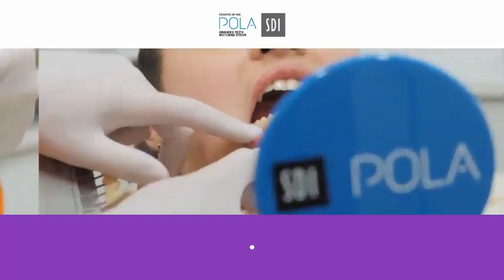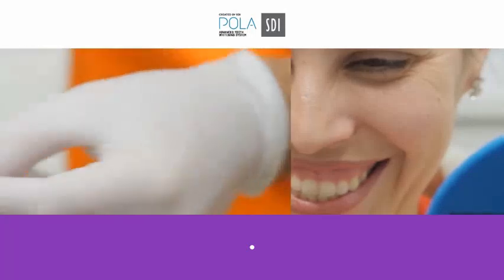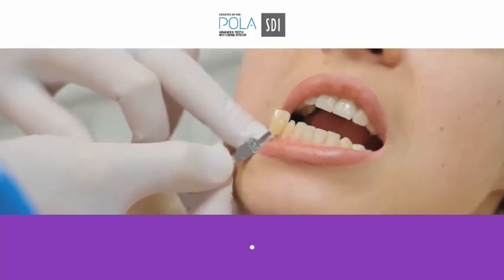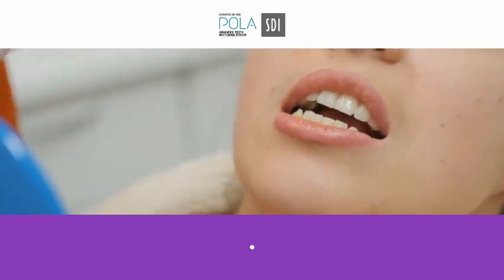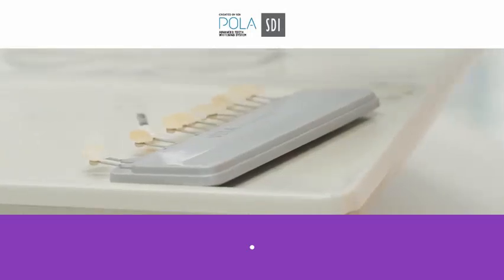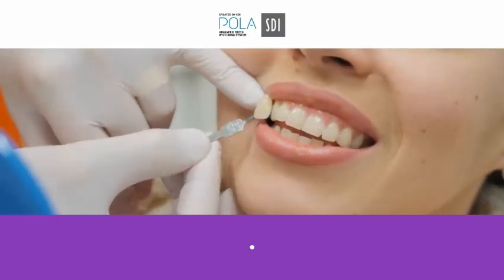So open, so we have a look at these bottom teeth. We're starting off at round about A3, just for your natural colour. Can you see that now? Yeah? And the canines, as we can see, are a touch darker. See, that's nice, A3.5, the darker colour. Can't remember what we said last time. So going back there, now if we look at where we sort of kind of moved to, have a look at these top ones.